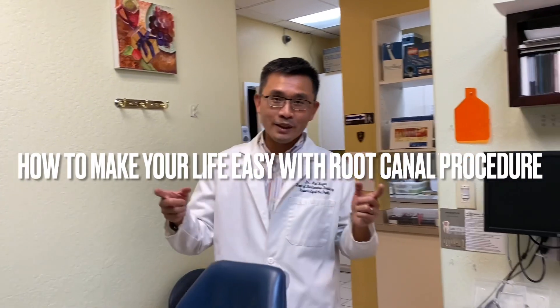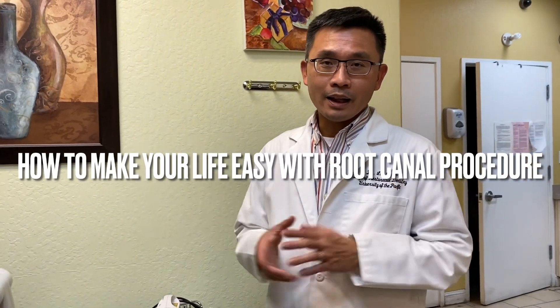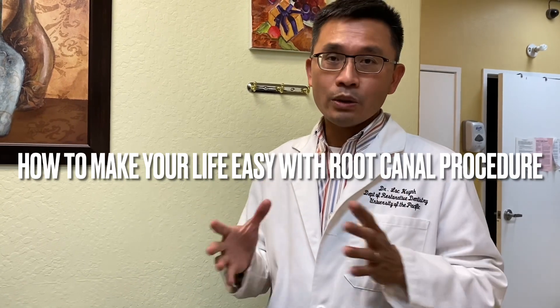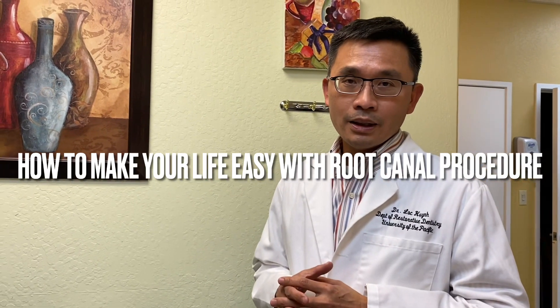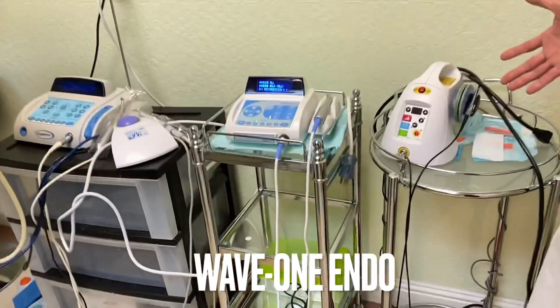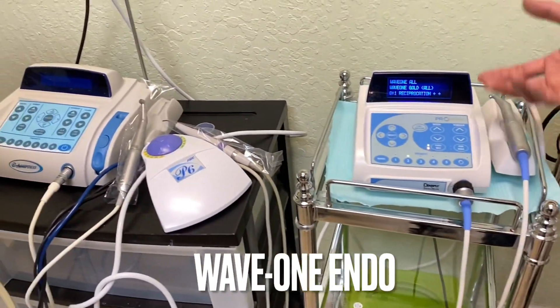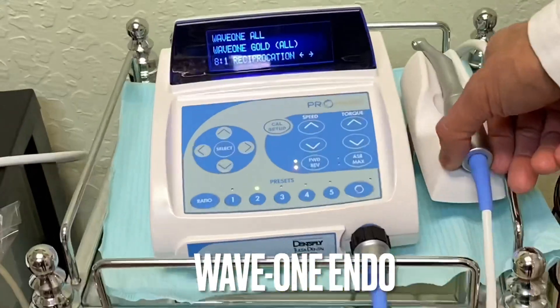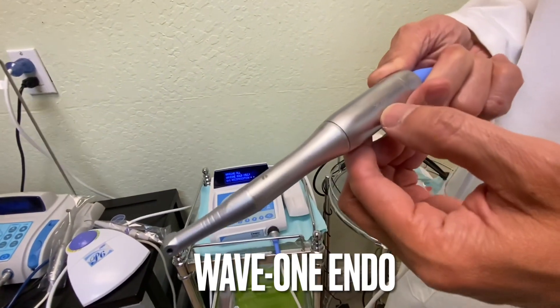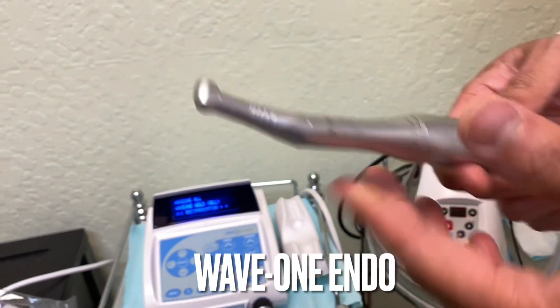Hey guys, welcome back to my YouTube channel. I'm going to show you something I'm very excited about that I've been using for almost a year and a half — it's the Wave One handle equipment. This is an amazing tool. You've got different kinds of tools here — laser, implant tools and all of that — but this is the tool that I love the most. It's the Wave One from Dentsply Sirona Dental.